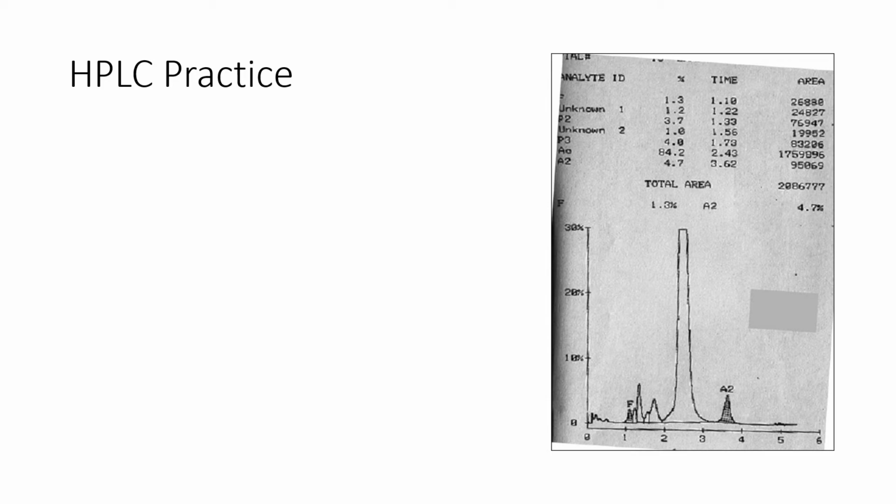Here's an example where the percentages for each peak are provided. So what do you think these HPLC results show?